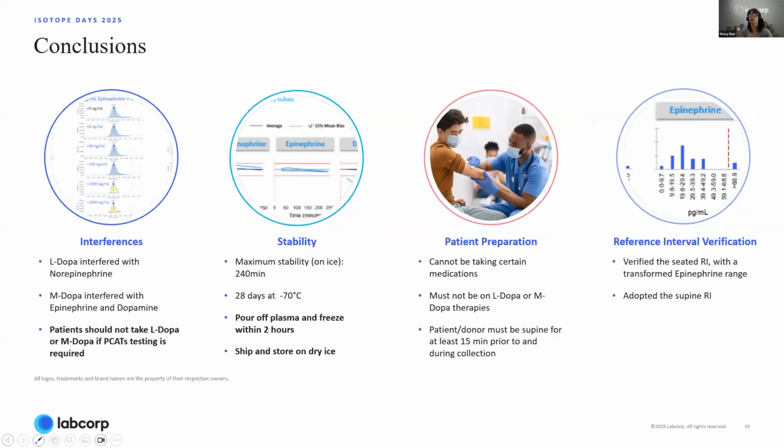So some conclusions. In spite of the interferences, the instability of samples, and the patient prep, we were able to thoroughly validate an assay that was accurate and precise with low matrix effects and a successful reference interval and conditions that we could use to move forward with extraction and collection.